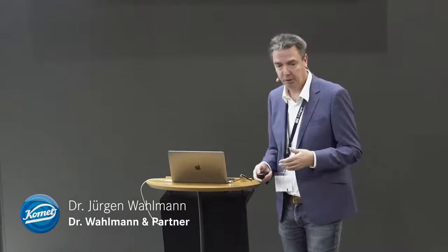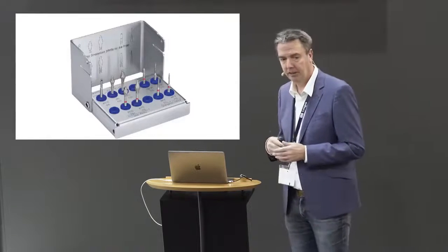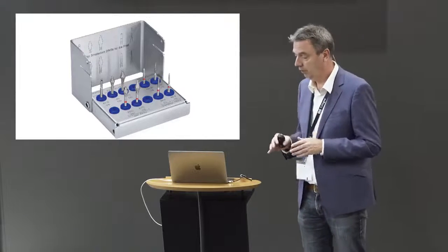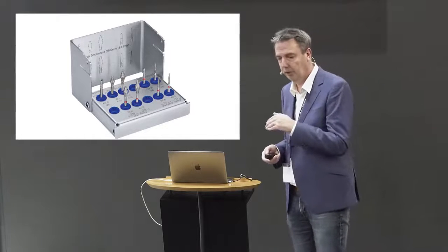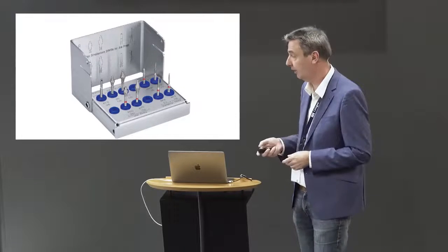If we do tabletops, and I always try, if it's possible, not to do a crown, to come back to the key point of the lecture. If it's possible, I just love to preserve the tooth structure of the patient. And there's a brand new kit in the market. This is developed by Dr. Ahlers and Dr. Edelhoff. This is especially for tabletops, and everything is inside the kit. Everything you need to create a very minimal invasive preparation on the one hand side, and on the other hand side, an extremely precise preparation.